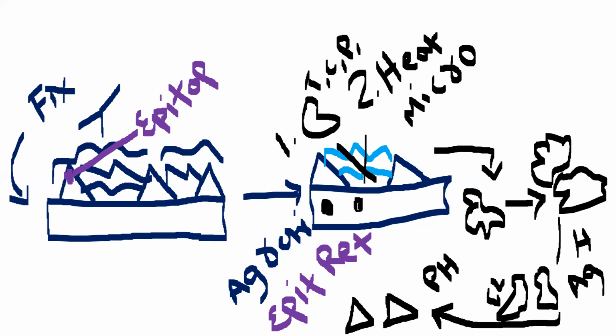So we need some modified heat inducing technique. The second modified technique is by using a pressure cooker. Just like the way we use an autoclave, we can use a pressure cooker to induce heat, and this pressure cooker can remove the crosslinks among the tissues. Okay, but still, a pressure cooker is safer than microwaving, but it has its own disadvantages.